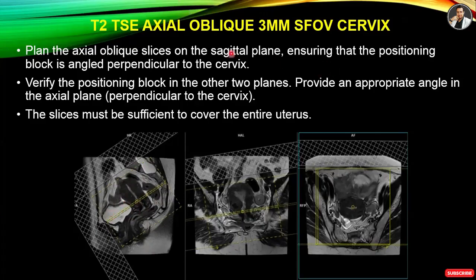Another technique I will tell you is that whenever there is a patient's MRI pelvis, male or female, we will keep some pressure in the bladder. It will be done with slight pressure so that the bladder can be seen clearly. If the bladder is empty, then the bladder is very small. So you can see the bladder well, check whether there is any problem with the bladder, and the uterus can be separated from the bladder. Understood?